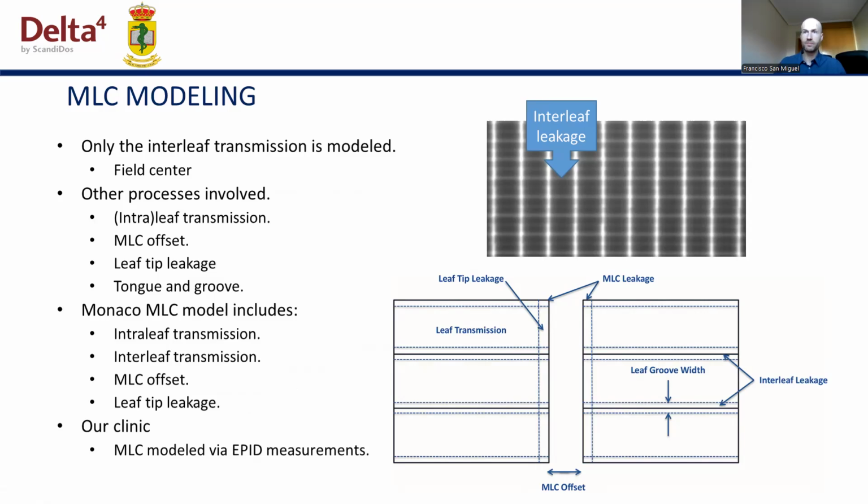In our specific case, we carried out this fine-tuning of the MLC using the LINAC EPID, which provides high resolution both spatially and dosimetrically, yielding very satisfactory results.